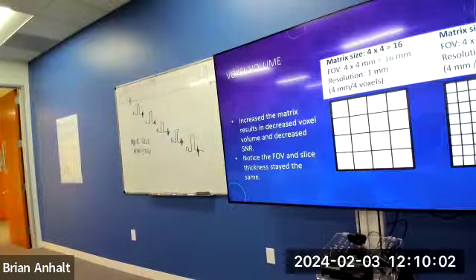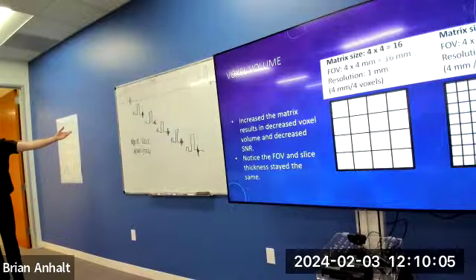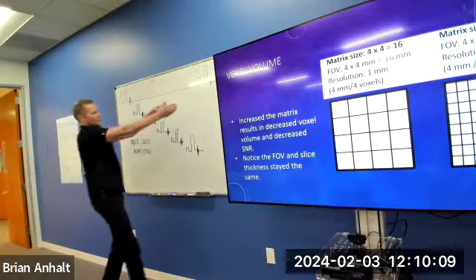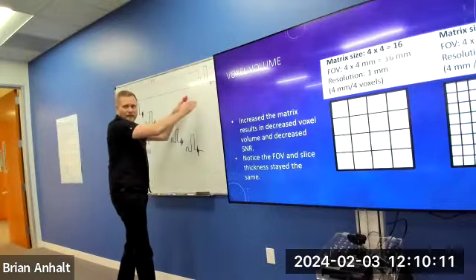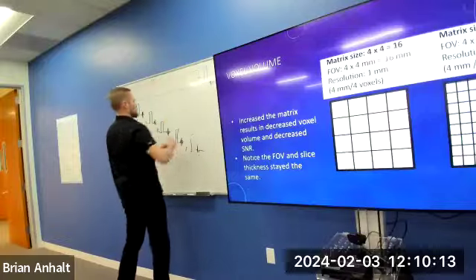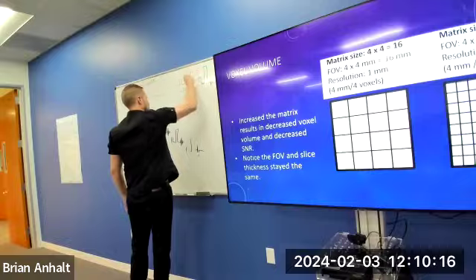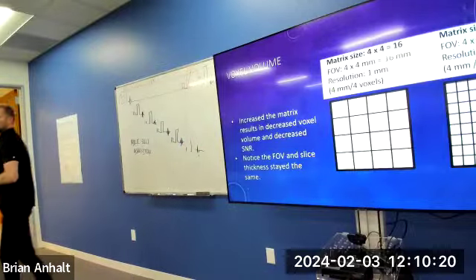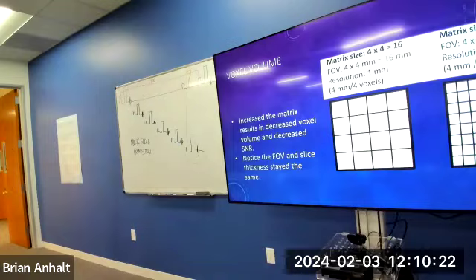And another thing it does is lower the amount of slices available, right? If I needed better T1 contrast here and I wanted to lower the TR a little bit, I'm losing SNR, but I'm also losing the ability to scan this slice, right? So that's something you have to consider with your parameters as well. You could potentially need to balance the amount of slices you have available per TR that you want.